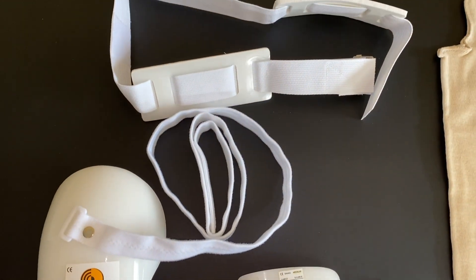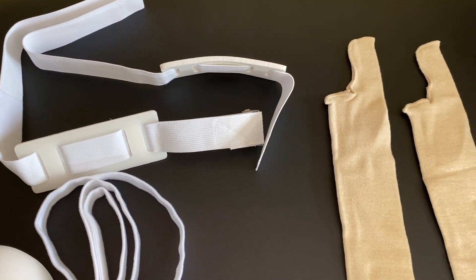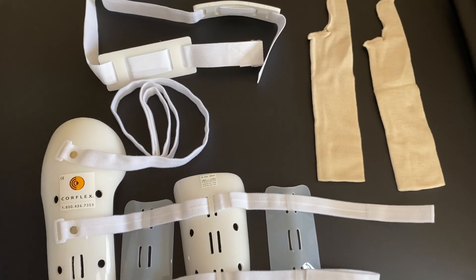While your arm may be uncomfortable initially after your injury, the use of this splint will assist in managing your pain. It is important to wear this splint as directed by your provider in order to ensure the best possible outcome.